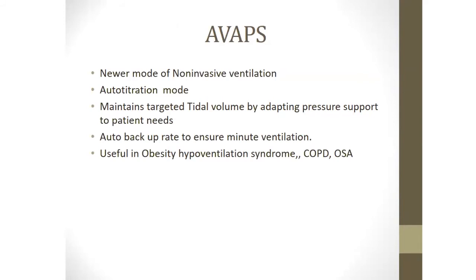In ST mode, inspiratory time is variable. For example, if the patient triggers his own breath in ST mode, the inspiratory time will be reduced according to the patient's comfort. In PCV mode, inspiratory time is fixed. That's the main difference between ST and PCV mode. PCV mode can become quite uncomfortable for some patients, so you have to be careful in which type of patients PCV mode should be used.